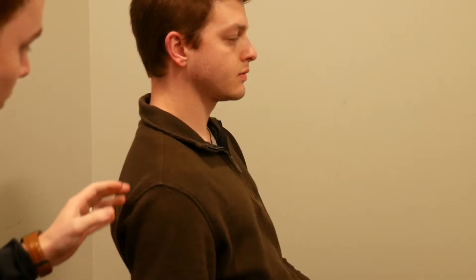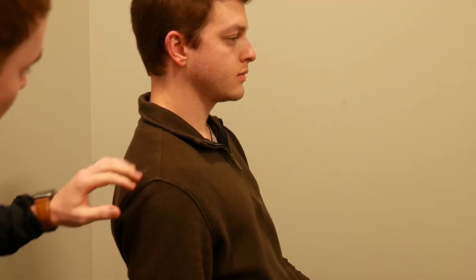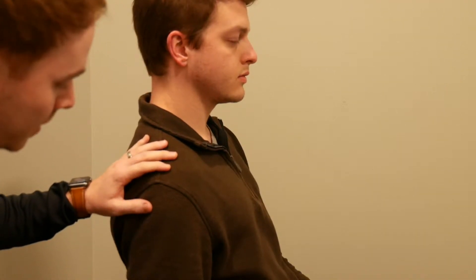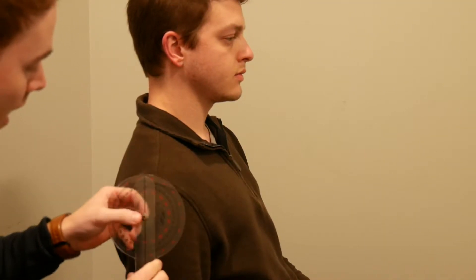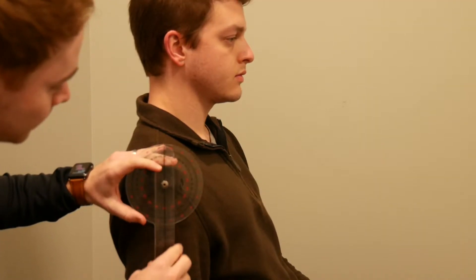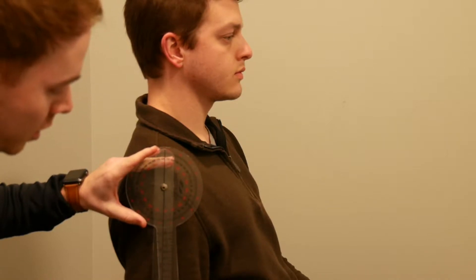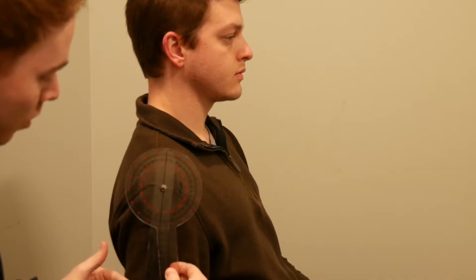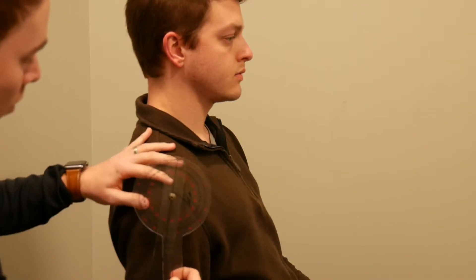Next we're going to measure shoulder extension. For this we're going to have the patient seated — it's just easier to measure than having them lie supine on a mat. We'll have their arm resting down by their side. The axis is going to be right over the acromion process, the stationary arm will stay in line with the trunk, and the movable arm will move along with the mid shaft of the humerus.